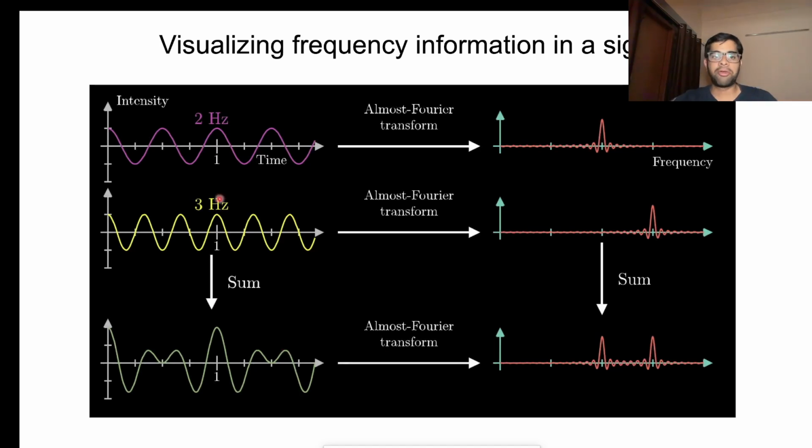So if you increase the amplitude of this sinusoid, that particular peak's amplitude also increases. I have one more related question: why don't we have this peak in the beginning itself, and why do we get it in the middle, or sometimes towards the extreme?